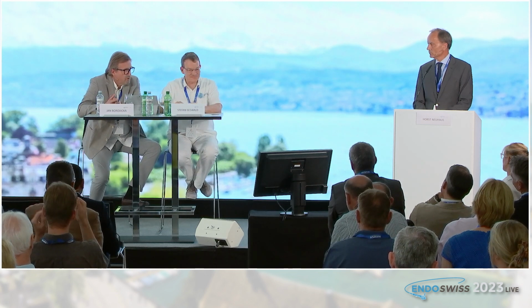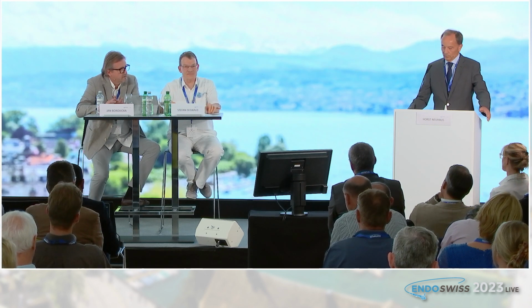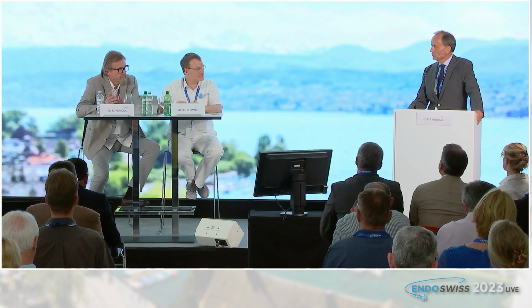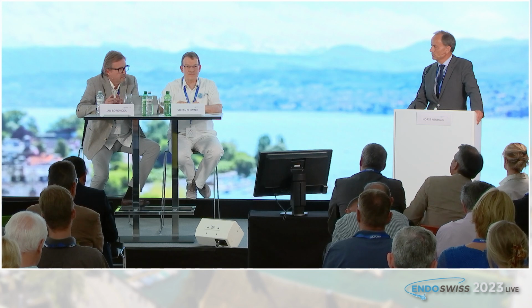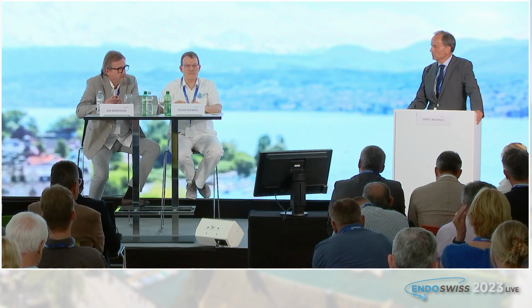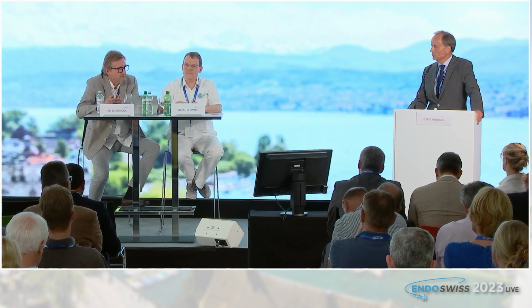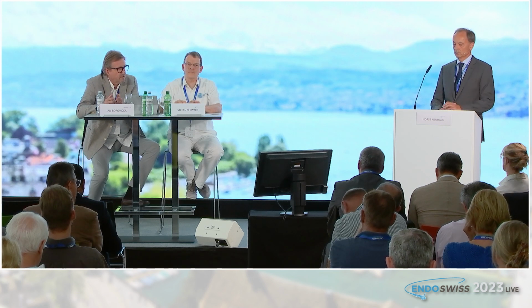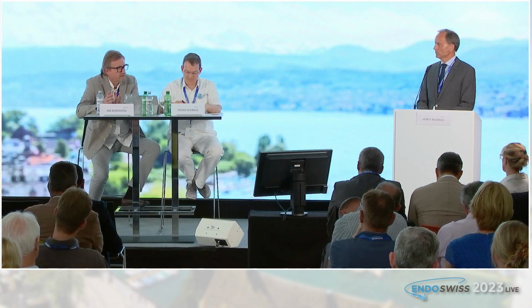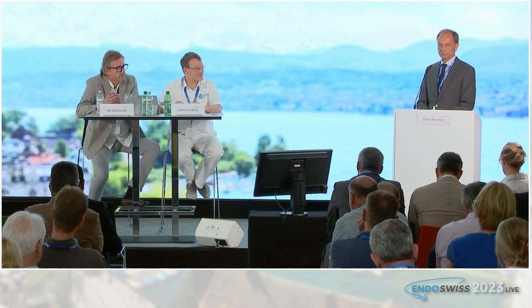So more and more we are talking about green endoscopy, and the single-use, single-operator cholangioscopy has several advantages, but the disadvantage is that, as you said, the classifications with NBI are not possible. If you start to introduce NBI in SOC, maybe it will be even more cost expensive. In which direction are we going? Will we be able to have a mother-baby system that is not so fragile, or what do you think?